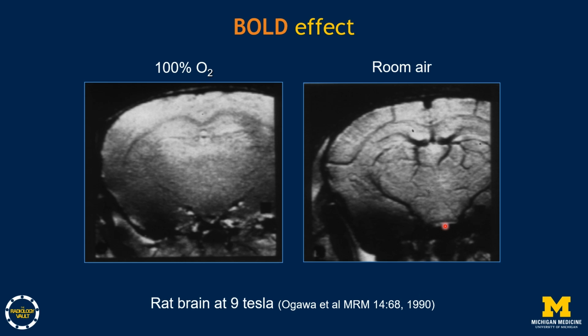Now, this is the very first BOLD imaging. This is an iconic image published in 1990 in Magnetic Resonance in Medicine by Ogawa.